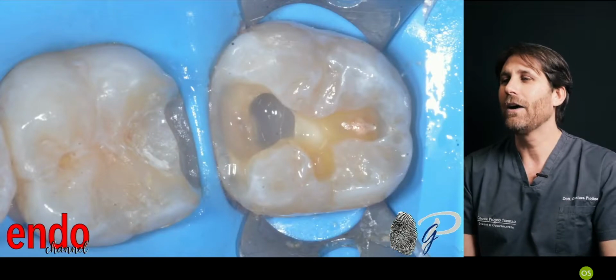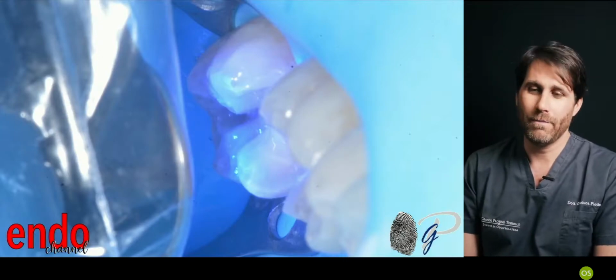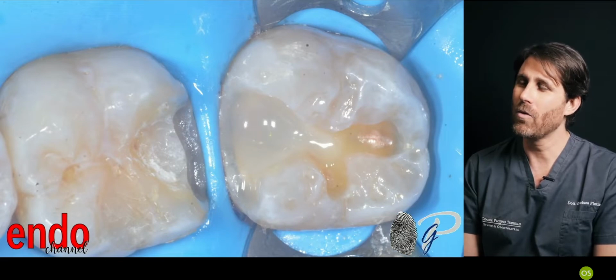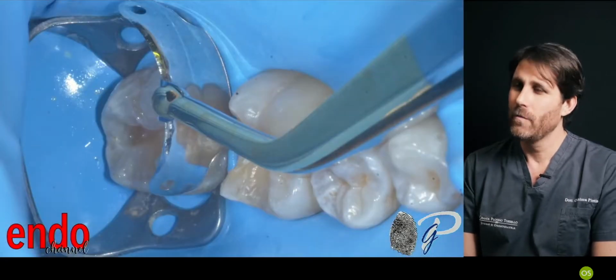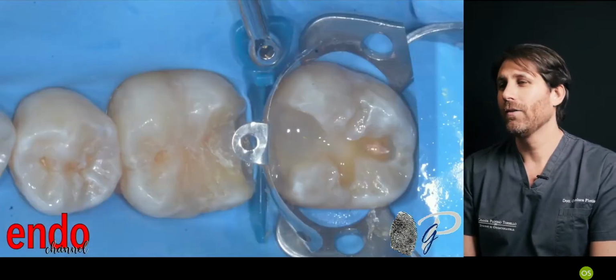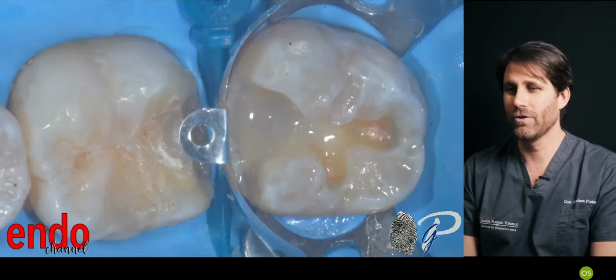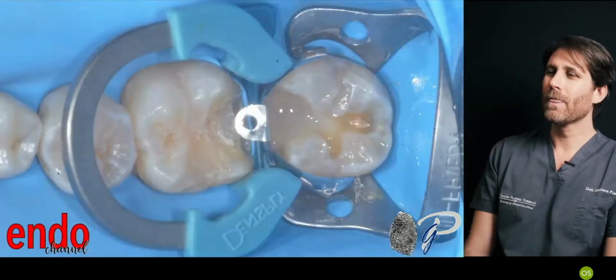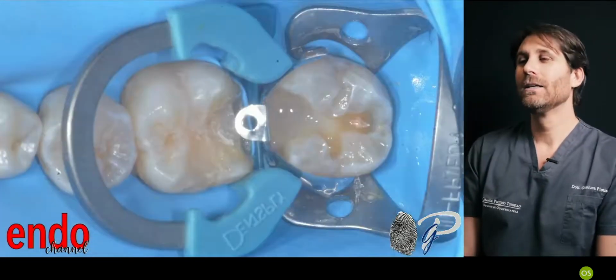And then after the flowable bulk fill layer, we use compactable material, we use an interproximal matrix, all the techniques for restoration that we all know, and we will see them in detail in the future in the endodontic channel.